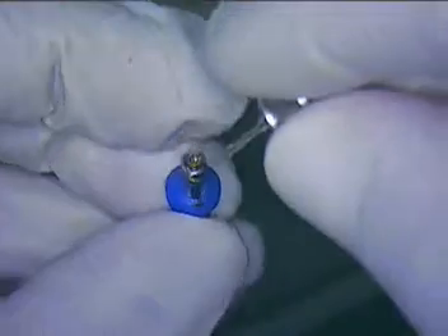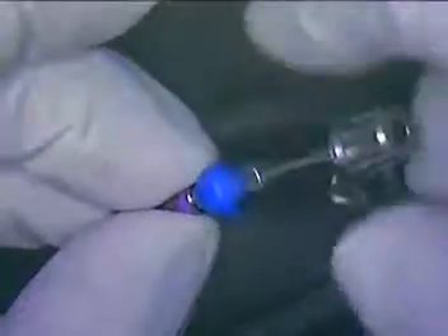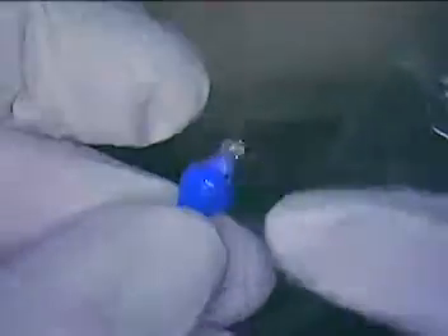Hi there, this is Dr. Jerry Cuomo. One more segment — I didn't want to forget how we put the analog back in the bone-level transfer coping. I'm going to do that right now. I'm hand-tightening. Now I'm going to use just a little bit of Vaseline, just a tiny bit, and just literally put a light coat and then rub it off with the two-by-two gauze, just so it slips into the impression a little more with ease.